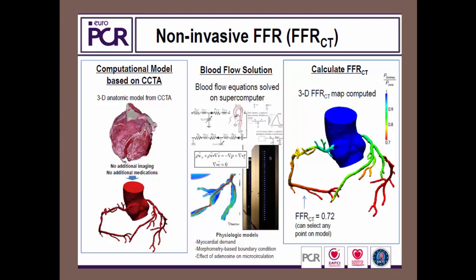This is based on an engineering technique from biomedical engineering called computational fluid dynamics. It's all about modeling the anatomy and deriving the functional information from the anatomy by outlining some input and output flow conditions. It's quite complex, basically. I've tried to understand it several times, but it's very difficult. But all they require to perform this analysis is the anatomical data that we obtain from CT angiography. So it's the same data, and there's no new data required for this. They put this data through a supercomputer at a company called HeartFlow, based in Stanford, in California.